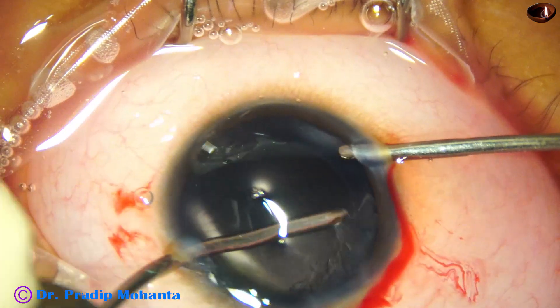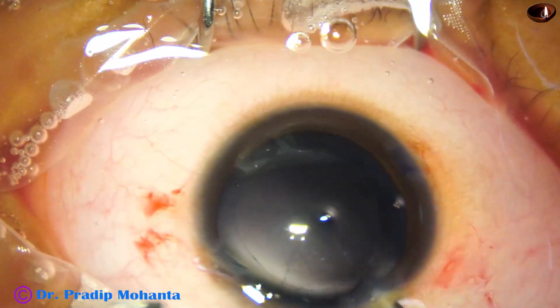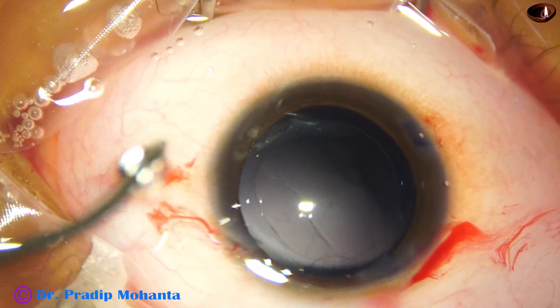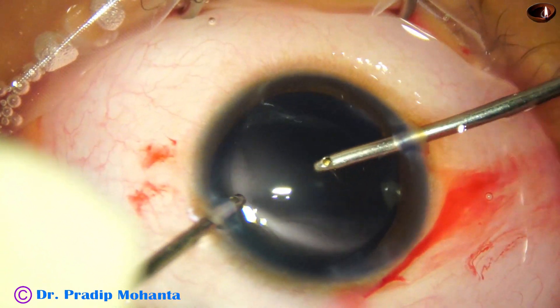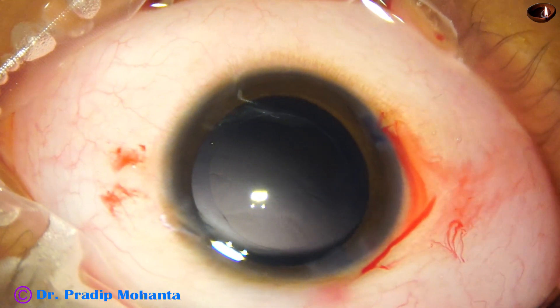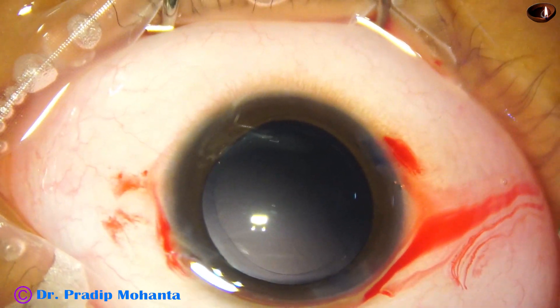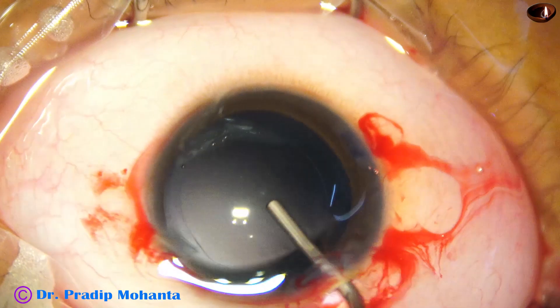The side ports are really small so I am using bimanual irrigation-aspiration for cortical cleanup. Cortical cleanup is complete. OVD is again injected to fill the capsular bag and the anterior chamber.